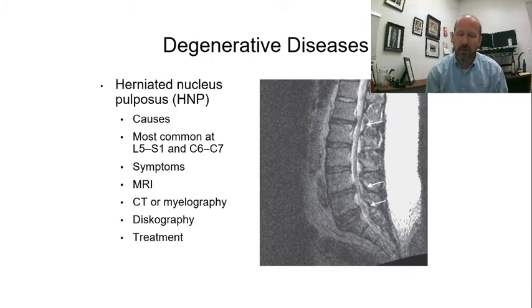MRI is going to be critical. Oftentimes, if we can't do MRI, like if they've had surgery and the metal in their back is causing the images to be obscured, we can do CT, but oftentimes it has to be preceded by myelography, so we have to inject contrast into the area of the thecal sac around the spinal cord. So this is not technically IV contrast, it would be intrathecal contrast injection. We do that under fluoroscopy, and then we transfer the patient to CT for the actual CT imaging of the spine.